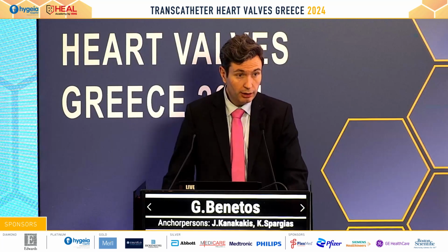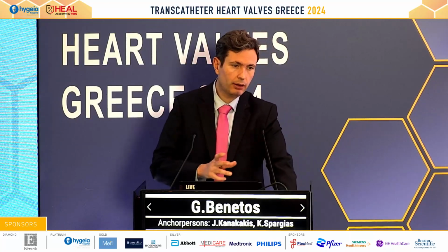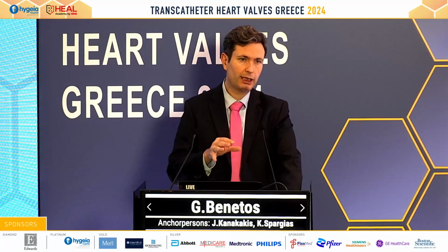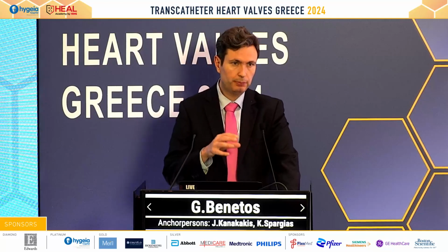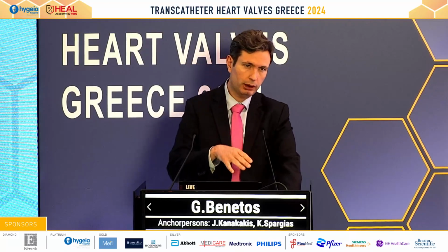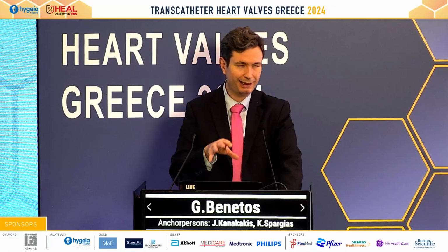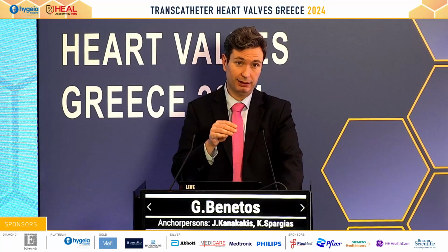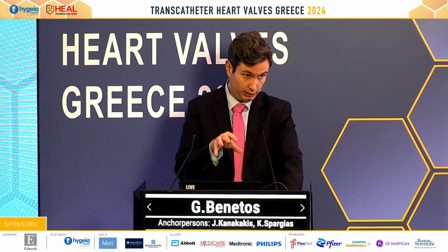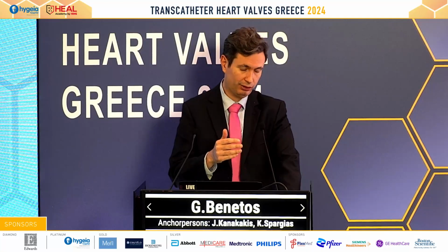Great questions both. Regarding the first question, if there are differences in measurements between 2 readers, then most of the times it has to do with the fact that they define different planes, and not because the one uses polygon or the other uses freehand contour. So if you have exactly the same plane in both readers, then either the polygon is suggested to use, but whatever method you use, it's going to give similar results.